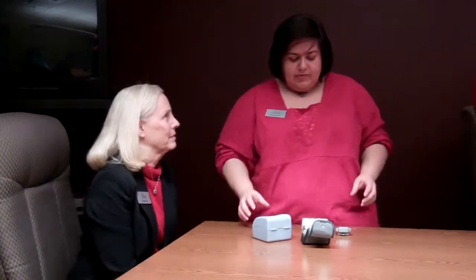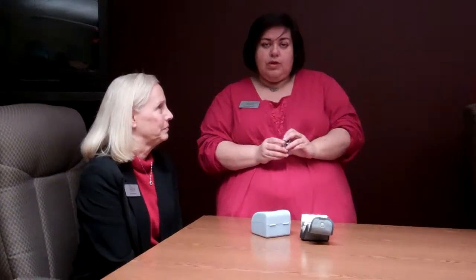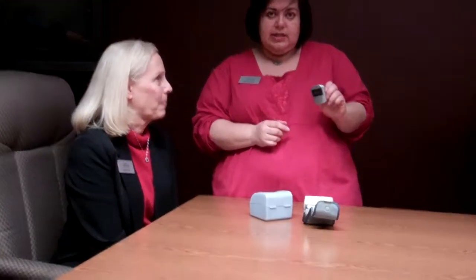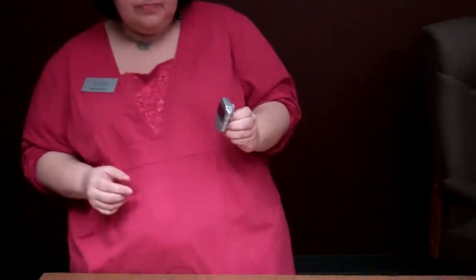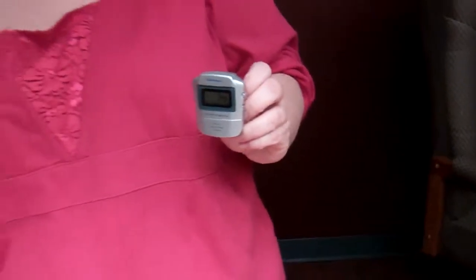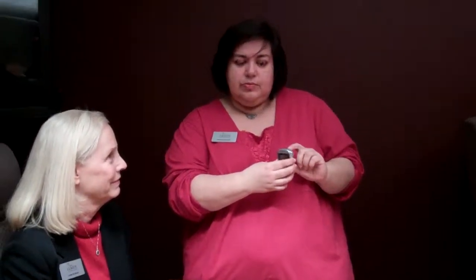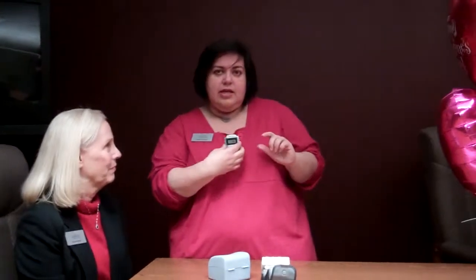The other item we're showing today is a talking pedometer. For people that are walking, this is just one kind that's out there. There are some that are run by GPS, some that you would wear on your shoe rather than on your waist. This one goes on your belt loop and stays perpendicular, and as you step, it tracks each step you take.